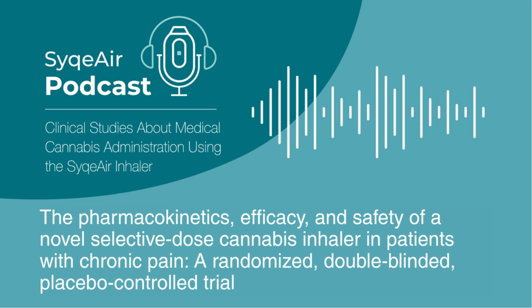Right. It also electronically controls and logs the whole process, and it's programmed to deliver specific metered doses. For this trial, they focused on 0.5 milligrams and 1.0 milligrams of THC aerosol per inhalation. Very small doses, metered doses, so aiming for individualization. Exactly, and they did quality control testing on the device beforehand. It showed really impressive uniformity in the actual delivered dose, meaning for the 0.5 milligram setting, the average delivered dose was almost exactly 0.5 milligrams, with very little variation. Same for the 1.0 milligram setting. That level of consistency from a plant product is quite something.